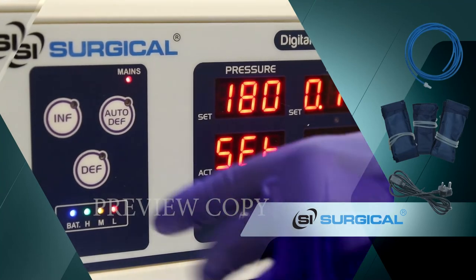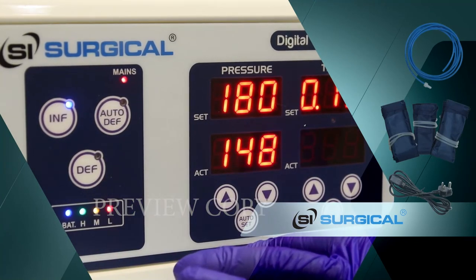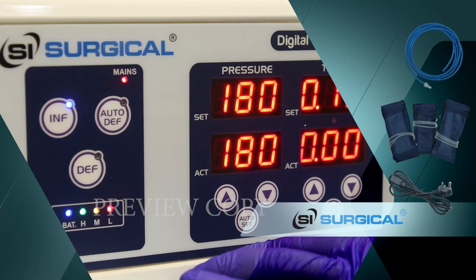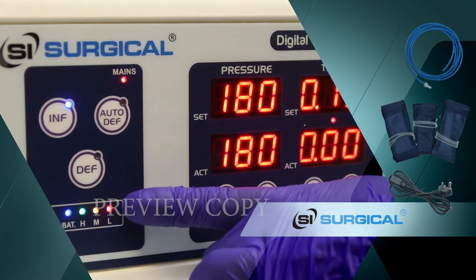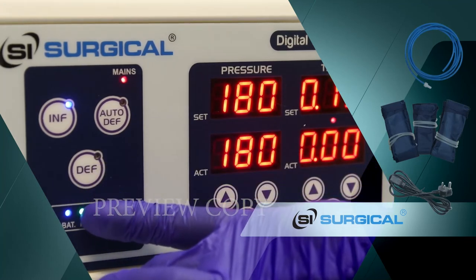We can set the pressure manually. We use the inflate button. This is not dependent on time, and the doctor can deflate as he wishes.